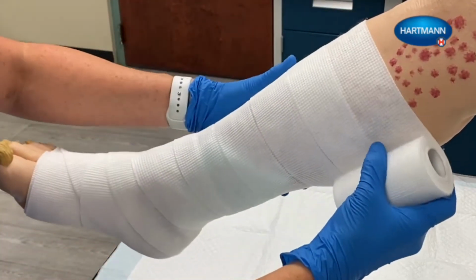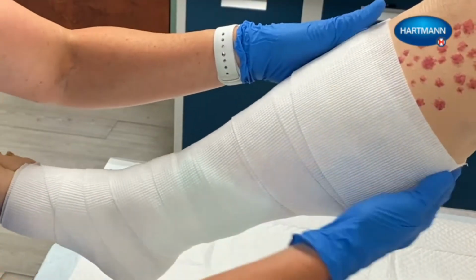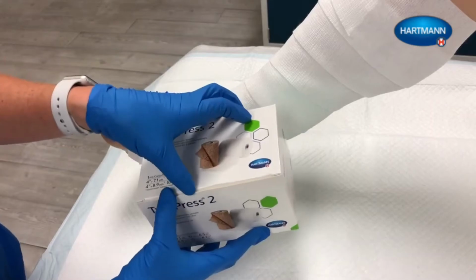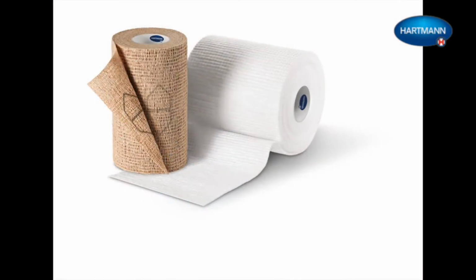Tear off any excess bandage material beneath the tibial tuberosity and about 2 centimeters below the fibular head. Additional fixation is not necessary. Tape can be used if required. Layer 2 is a long stretch cohesive compression bandage that locks in the first layer and features a visual indicator that supports correct and consistent application.